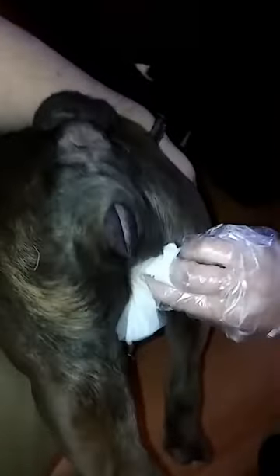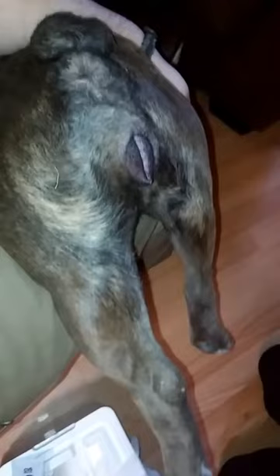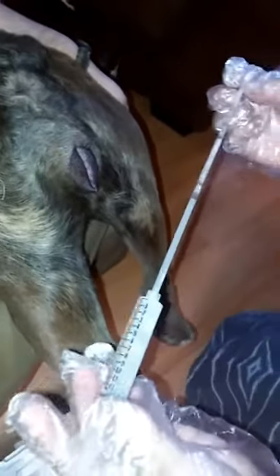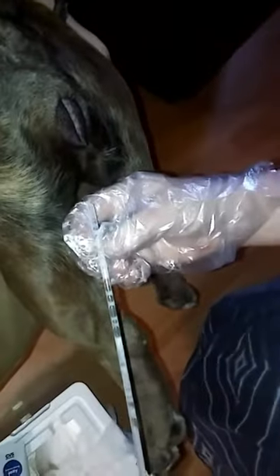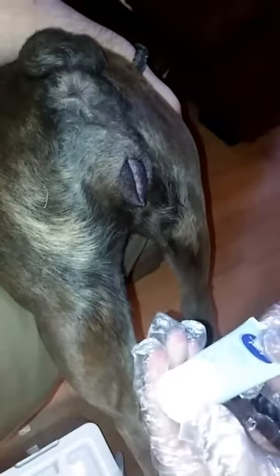First, we're going to start by wiping off this dirty swat with a baby wipe. Get her all excited. Got our semen ready to go — AI rod. Got to make it wet.